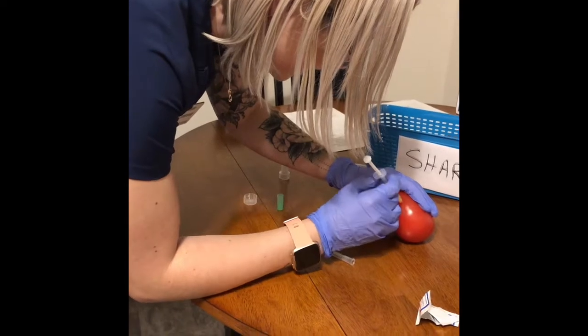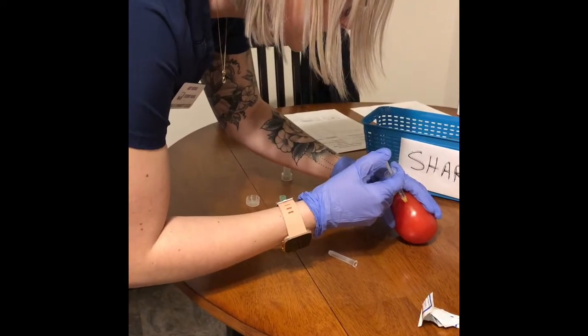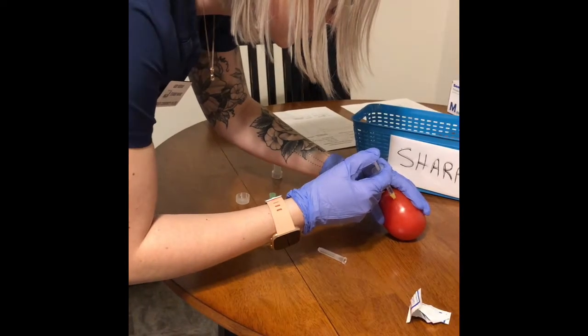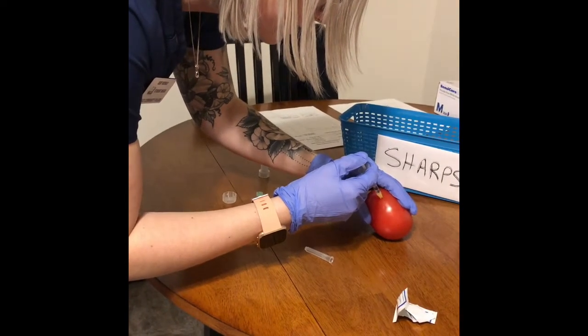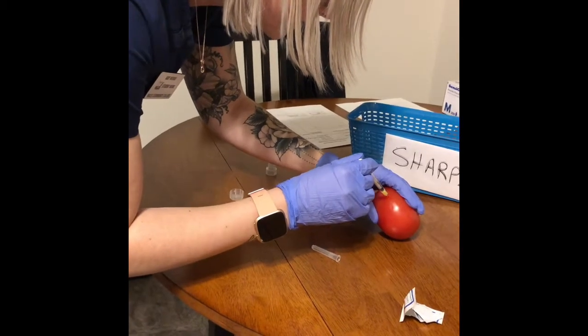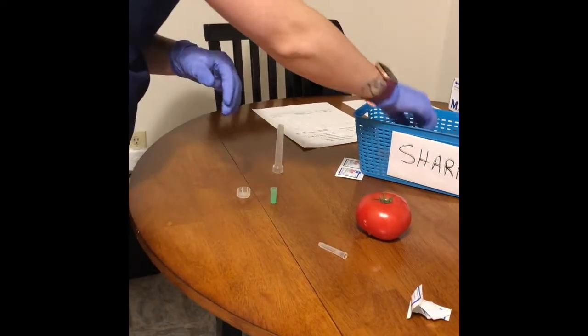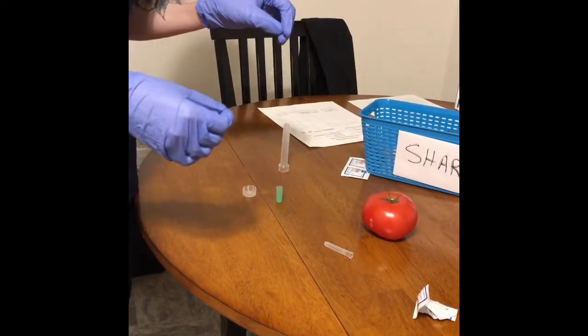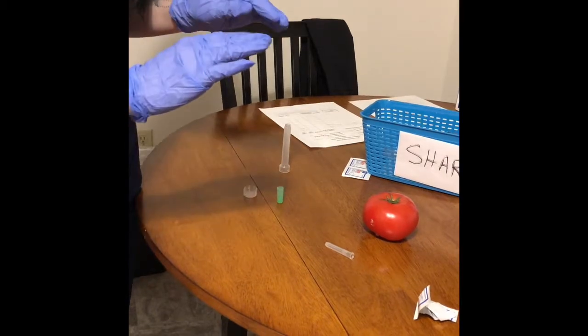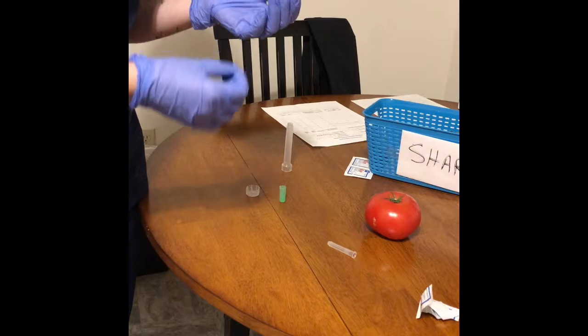Okay. And then you want to inject it a little bit slowly. And you also want to inject the 0.2 milliliters of air. Okay. Then you can remove it, put it right in the sharps container. You can blot it with a gauze, but you don't want to rub it or massage it, and I advise the patient not to rub it or massage it either.